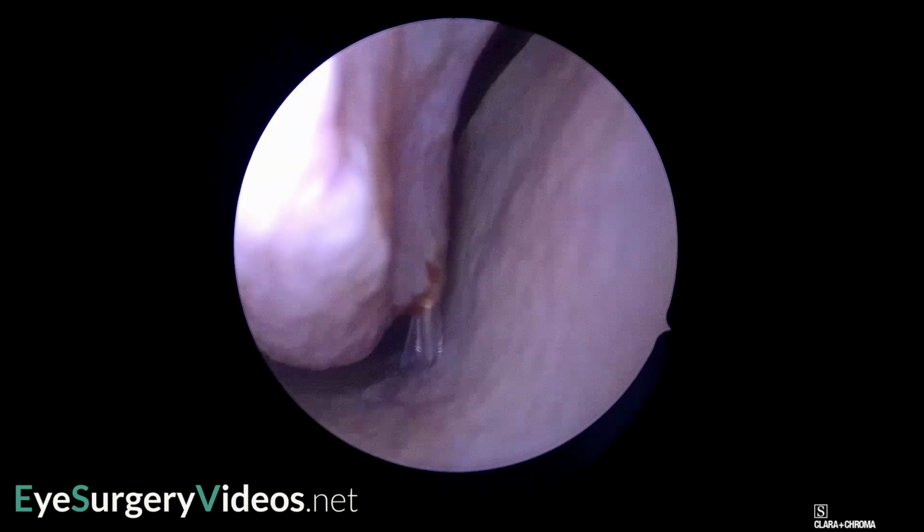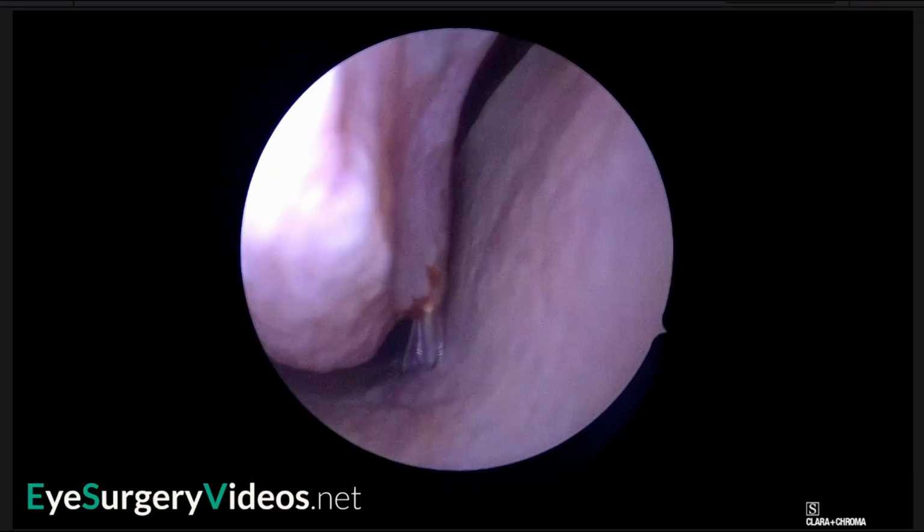Formation of a false passage has several issues. Firstly, it causes unnecessary tissue trauma. Secondly, it will only achieve the aim of overcoming an obstruction or dilating a system if there is a portion of the stent in the correct location prior to it starting the false passage, and the obstruction or stenotic region is in this section. Thirdly, the stent is likely to be much more difficult to remove, as it will be held firm by the surrounding tissues and may snap on removal.